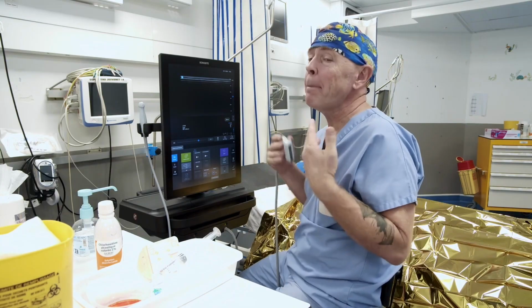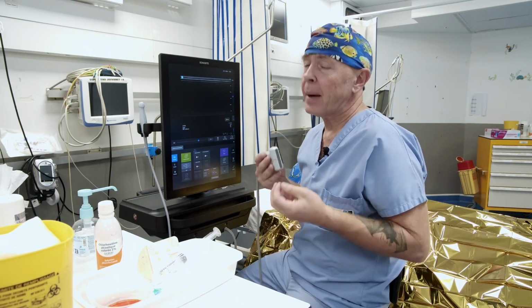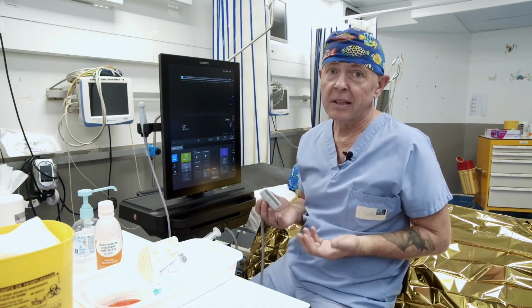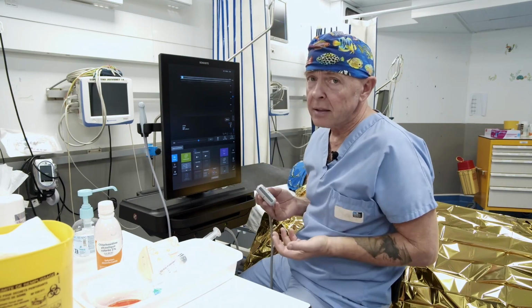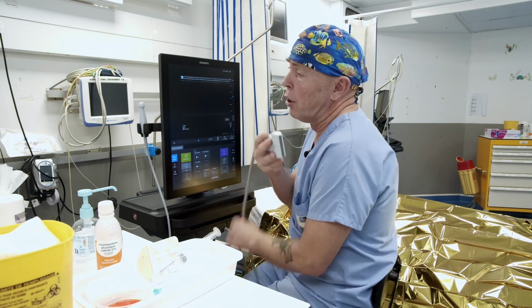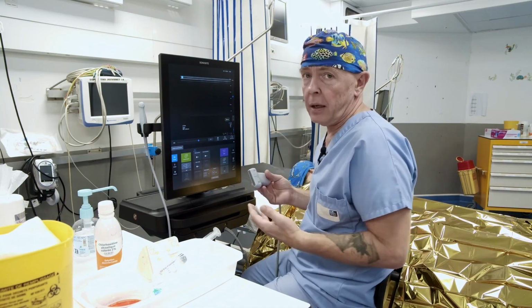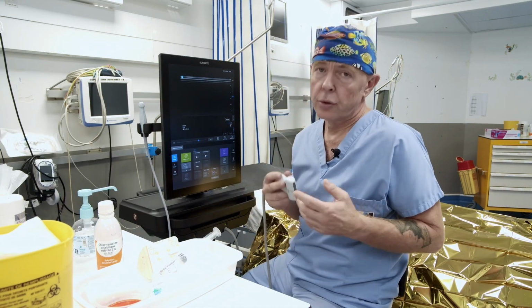And it is solely from that particular moment onward that you are able to commence practicing on your patients. All right? That could be the most crucial message. Do not bypass any steps. If you desire to acquire a methodology that is highly effective, practical, secure, and most importantly, optimal, it is crucial to adhere to the steps in this specific sequence. Only after thoroughly completing these steps can you initiate your regional anesthesia with the assistance of ultrasound guidance.